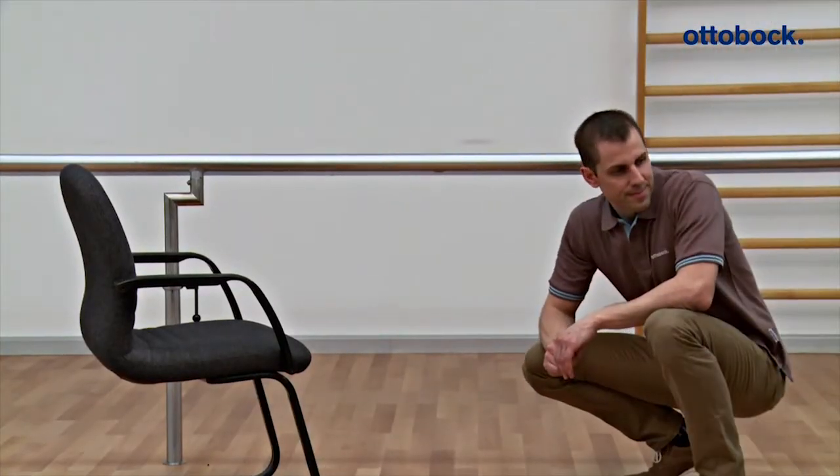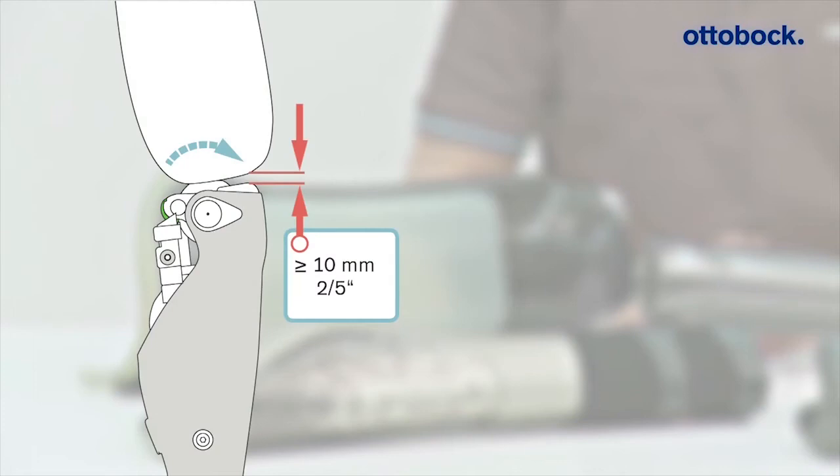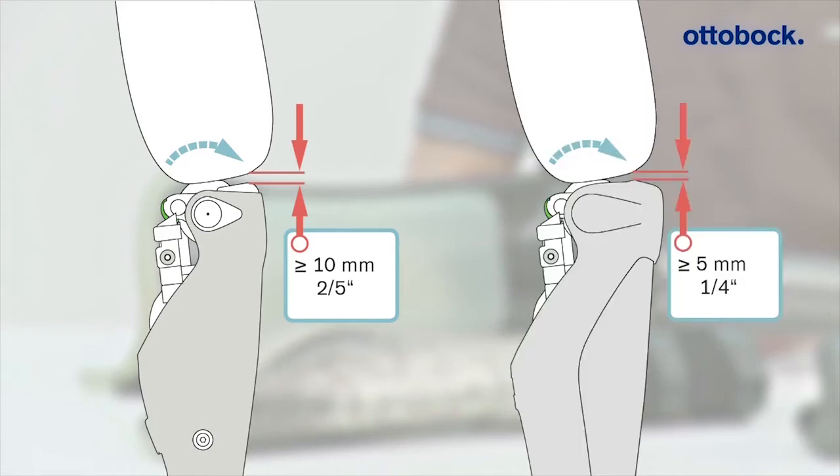If a C-Leg 4 protective cover needs to be installed later, the required safe distance between the prosthetic socket and main electronics increases from 5 mm to 10 mm. This is necessary as an installed protective cover later reduces the available space by 5 mm.